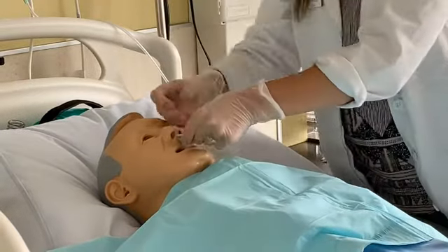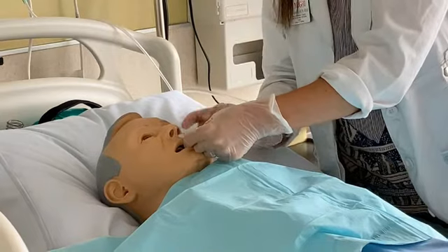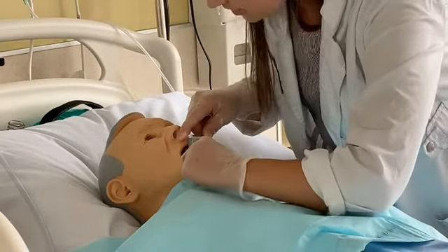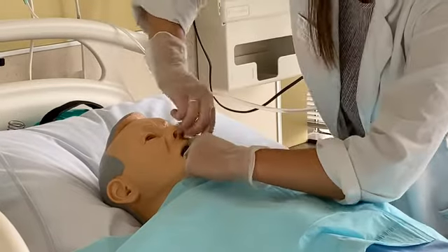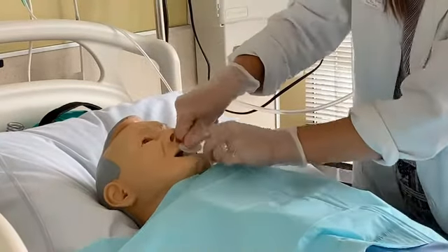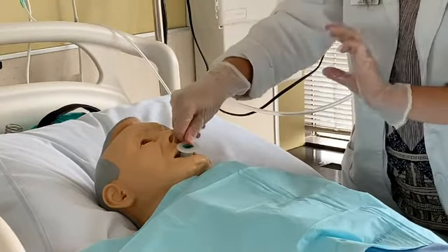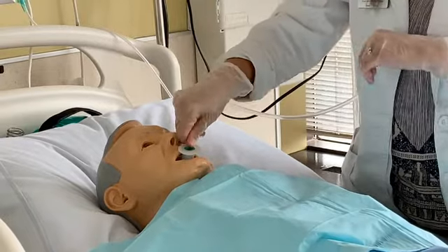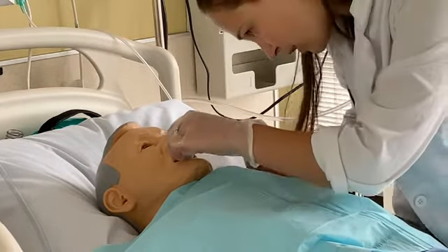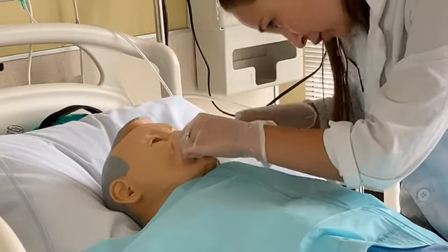Okay, so once the flange of the airway is parallel with the patient's nose, and I can see that it's resting on top of the patient's tongue, I will invert this piece, and it will actually physiologically displace the tongue and make sure that the tongue is under the oral airway. So then I will check to make sure the placement is correct. I can see that the tongue is being held by my airway.